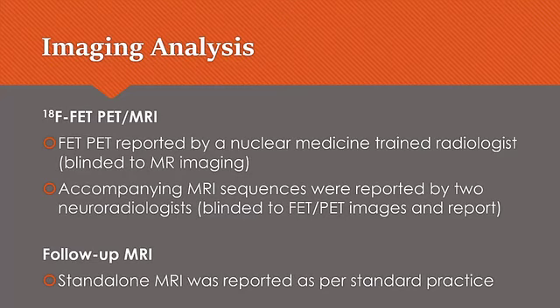Post-imaging, the 18F FET PET images alone were reported by a nuclear medicine trained radiologist, with the accompanying MRI sequences blind reported separately by 2 neuroradiologists. The follow-up standalone brain MRI was reported as per the centre's standard practice.